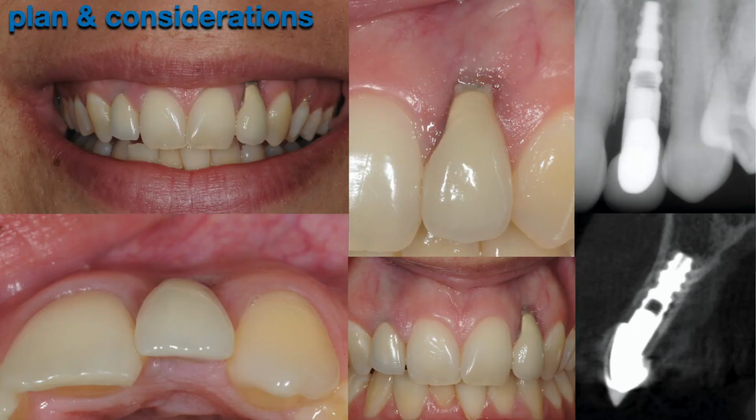Obviously the question is, can we keep the implant? What's bothering you? There were a couple of things that bothered her. Not only was the metal collar exposed, but the tooth was so much narrower than the symmetrical tooth number 7. The width of this number 10 lateral incisor was only 5.5 millimeters maximum of the clinical crown. She didn't like that.